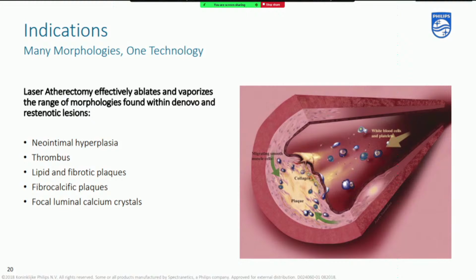But I found out in the iliacs, which is off-label use, if I had really hard calcified plaques in the common iliacs and couldn't pass with the EVAR device because of 16 or 20 French, it's quite similar to lithoplasty because of the cavitation bubble. You can disrupt the calcium and then dilate with the balloon and pass as well with the EVAR device. It's off-label use, but I think, as well, with young patients which are calcified, I still try to prevent stenting.